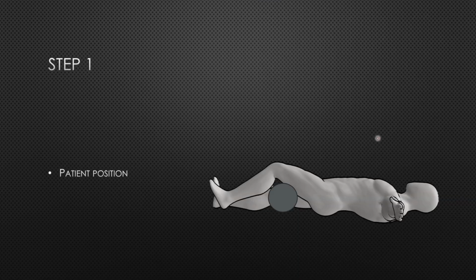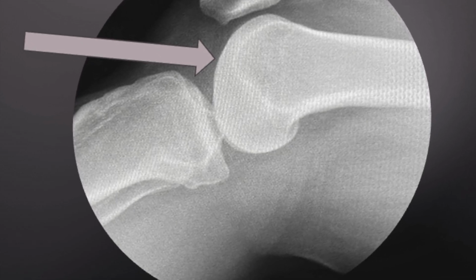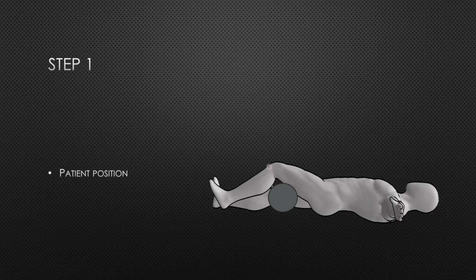Now the first step is to position the patient. The nailing has to be performed in a supine position. You can use a translucent angled support for the knee joint, which brings the knee joint into 30 to 40 degree flexion, or you can use a bolster also. By that you will be able to bring the terminal part of the trochlea directly underneath the patellar tendon, because ultimately you have to insert your guide pin through the slit you have made in the patellar tendon, or you can retract the patellar tendon medially. So this is the position that you need for distal femur nailing.